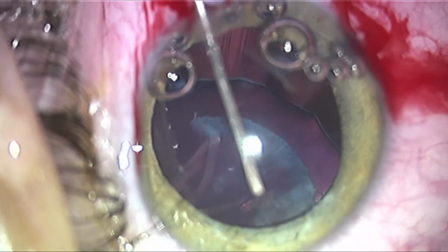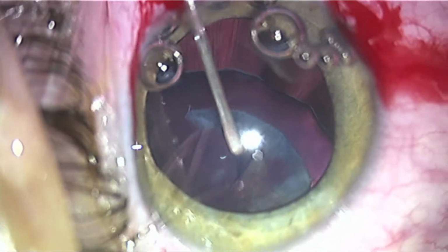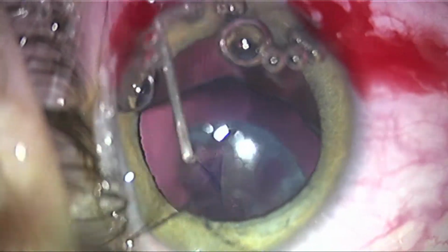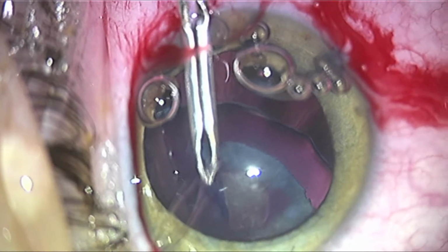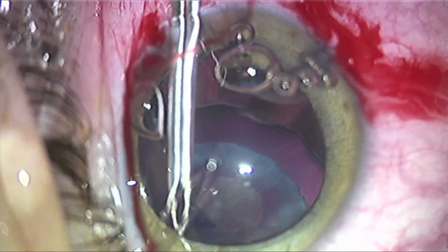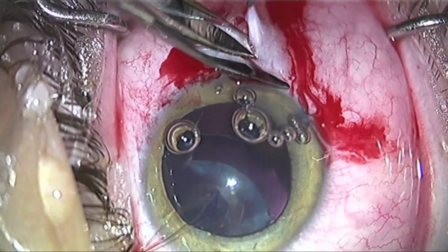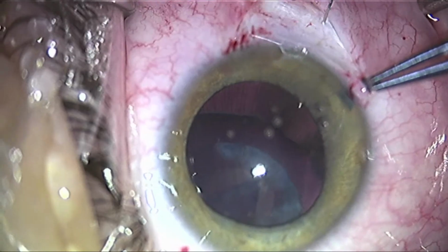You want to try and center this capsulorhexis where the final lens position will rest. And this side is very difficult given the zonular laxity, as well as the fact that only a part of the lens can be seen. So what we did here was just stop the rhexis at the edge of the iris. We were planning to place an Ahmed segment, so a peritomy was made temporally.